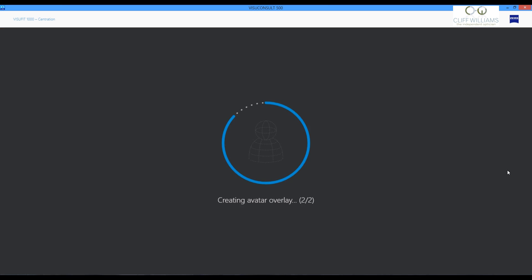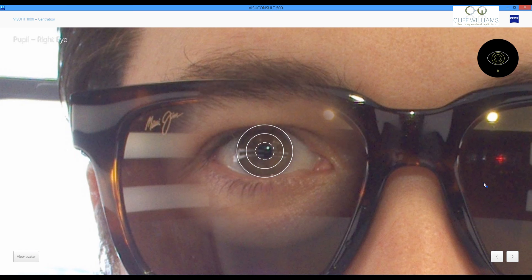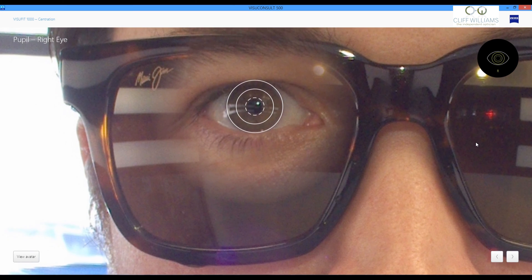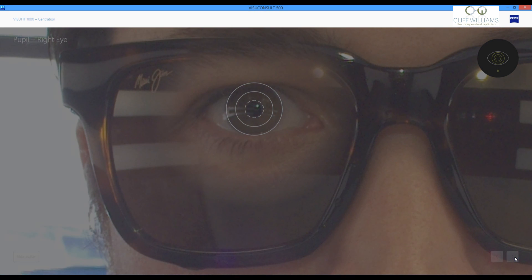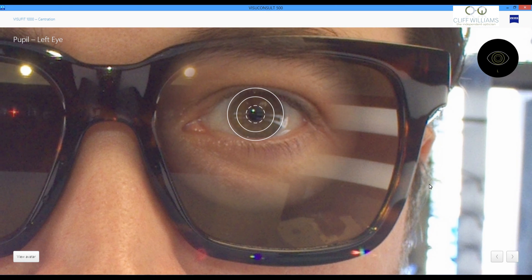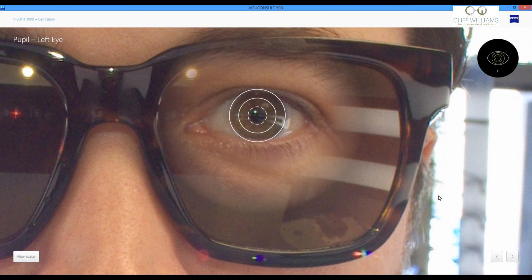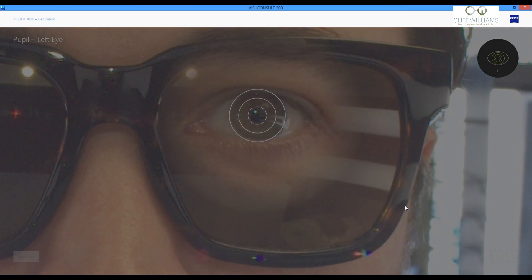And now it's going to overlay the avatar with the frame. And we can see right away we're able now to see the eye to check the position of the pupil. Precision is key to make the most out of the optics. And this allows us to do so.